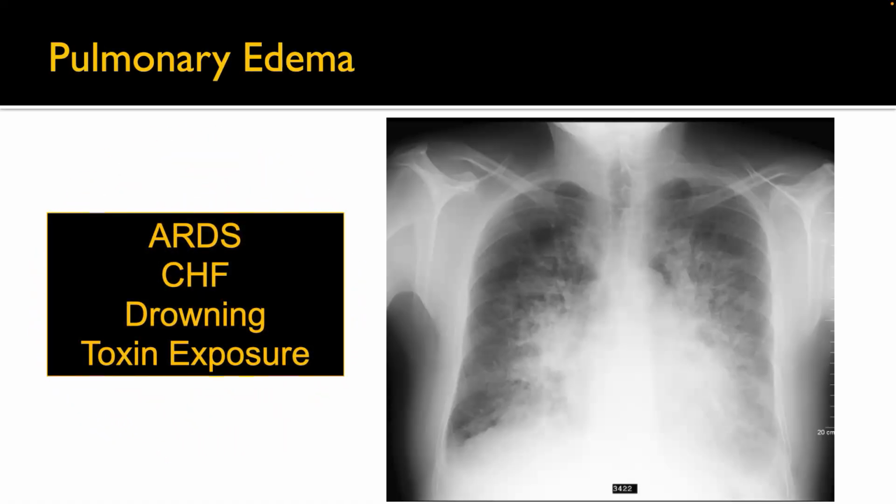Fluffiness. Anything from that standpoint, pulmonary edema, ARDS, CHF, drowning, toxic exposures, all that stuff will cause this fluffy pattern.